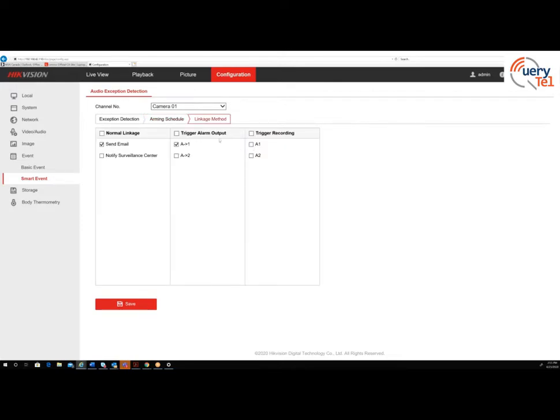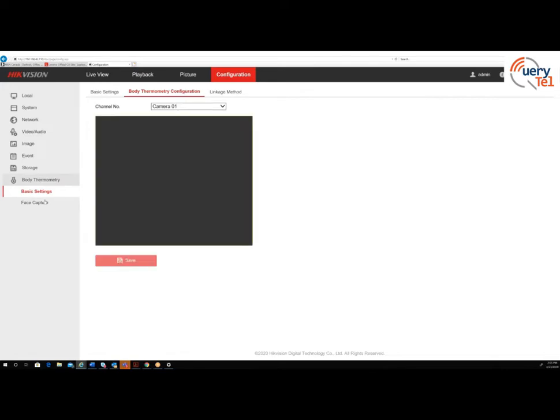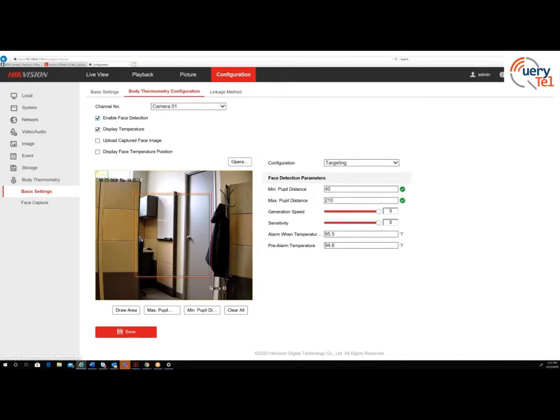Okay. I haven't done anything on that. You guys can figure it out. So linkage, this is my temperature reading. And let's take the temperature. So sit here for 2 seconds. 3, 4, 5, 6, 7, 8, 9, 10. Come back.